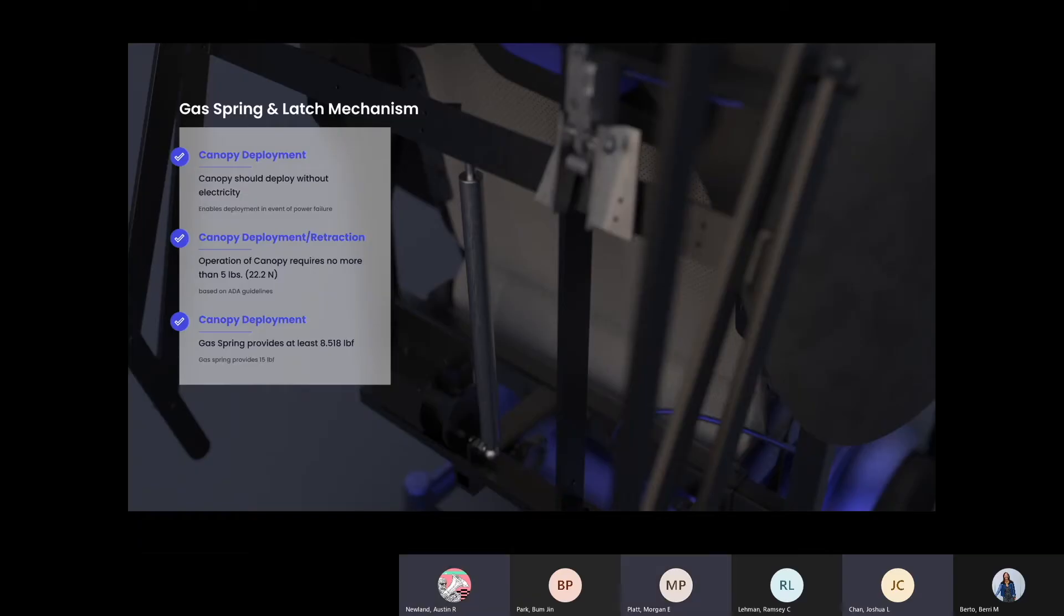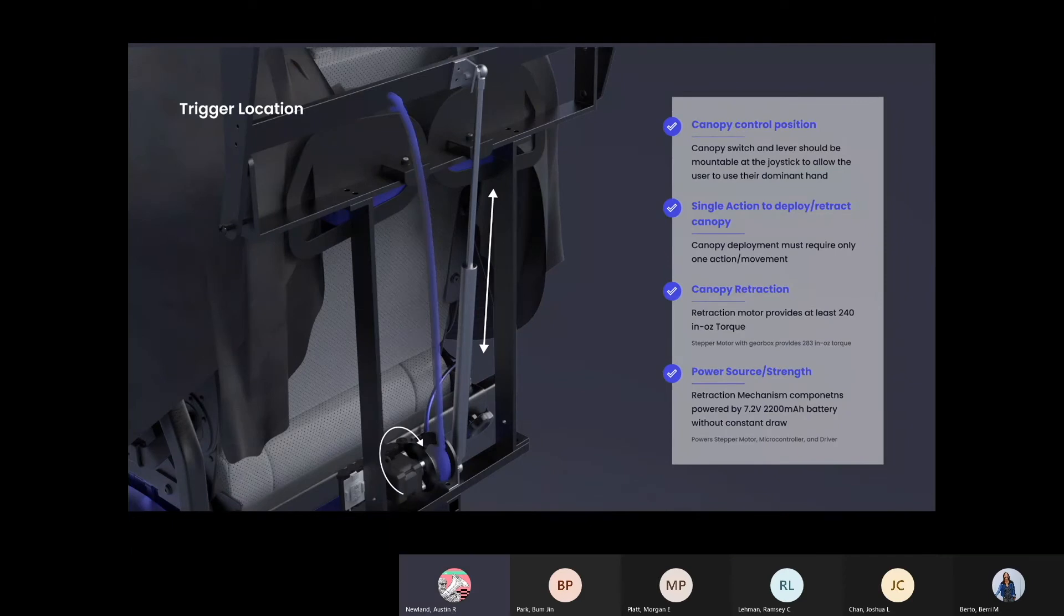As mentioned, the canopy is deployed with pull of a handle, which opens a rotary latch and releases a gas spring. We chose this method because it was important that the canopy deploy without electricity, enabling operation even in the event of a power failure. The canopy is retracted using a stepper motor, which is powered on to retract the canopy and then unpowered at any time to save battery.